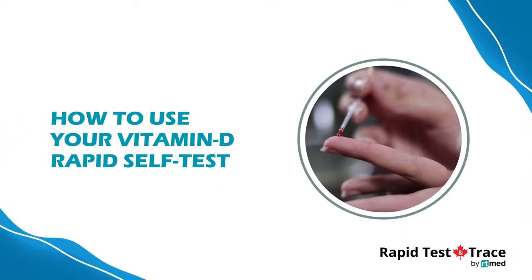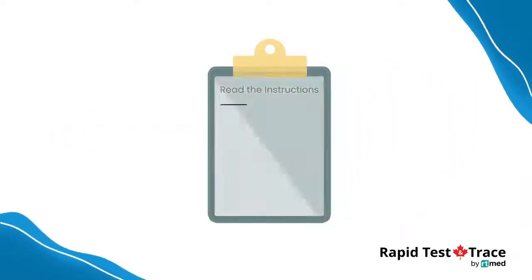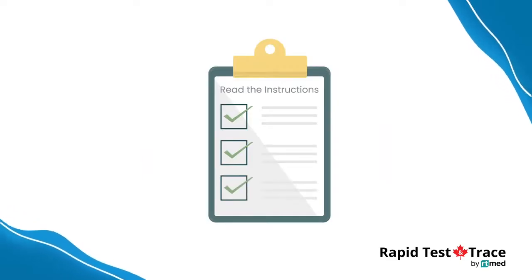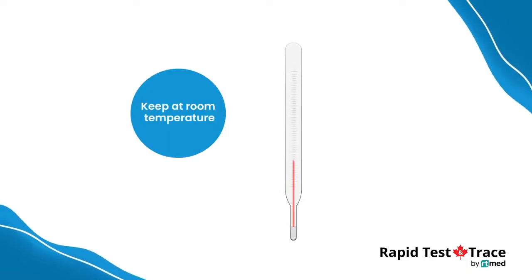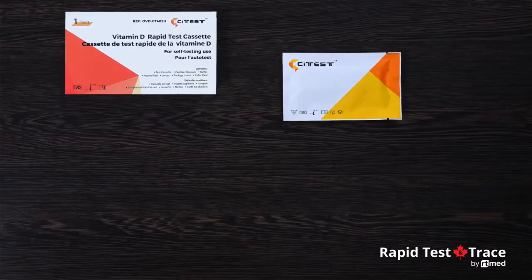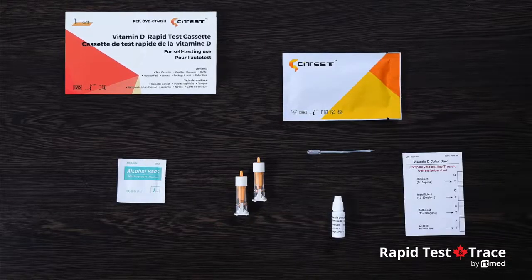This video will explain how to take a rapid test for vitamin D deficiency. Before you start, please read the instructions including the precautions listed in the leaflet. Ensure that the test cassette pouch is at room temperature before opening it. Check you have all components listed on the packaging and ensure you have a clean work surface to lay out your test kit.